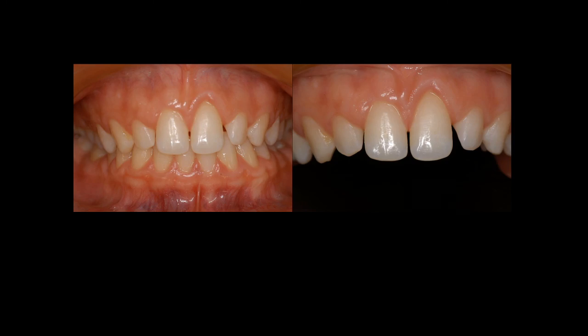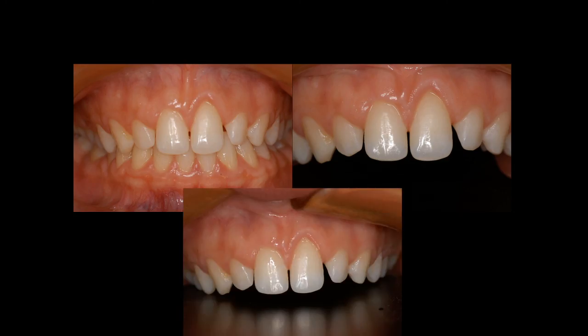As you can see, this is her occlusion. She has a nice, good occlusion, but unfortunately she has a reverse upper curve of the incisors. When approached for orthodontic treatment, she refused, and systematically refused. But analyzing the situation, even if we do orthodontic treatment, we'll have to end up doing some veneers layering because of the size of the teeth. The laterals are too small, and the centrals are relatively too small also. We needed to add some width to the teeth.